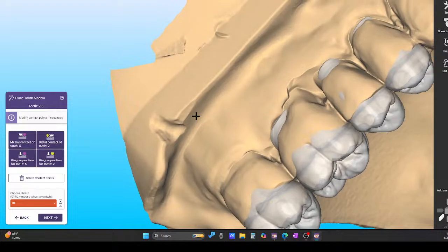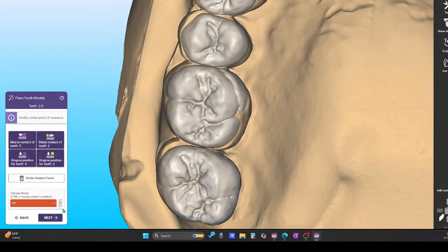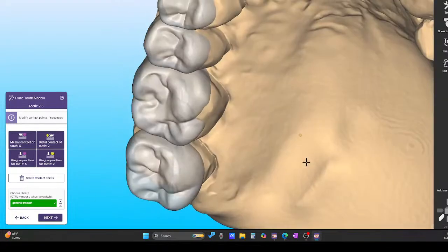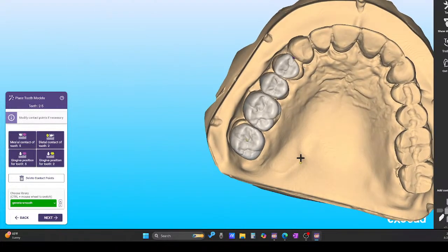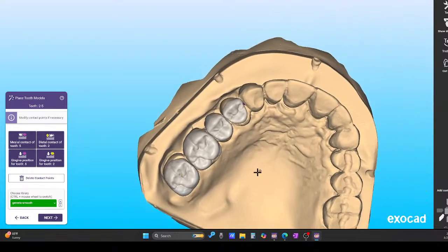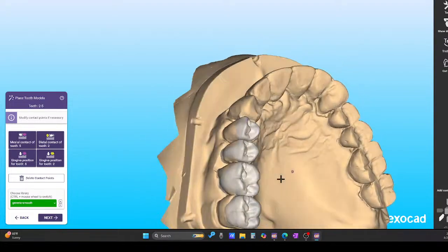This one has a lot of anatomy over here too. And this one is smooth. I actually like this one too. And it's not a bad fit also. Okay, so I think I'll go with this one. So let's see.